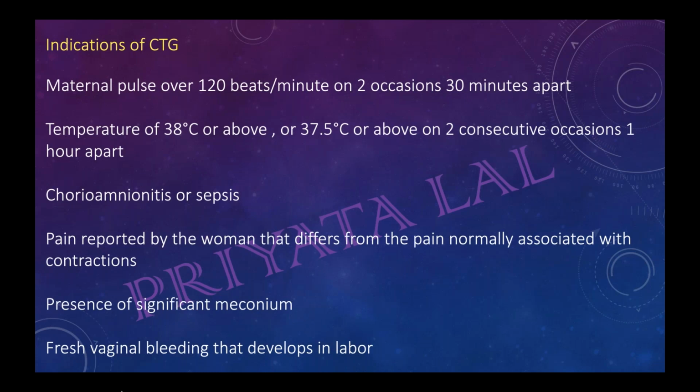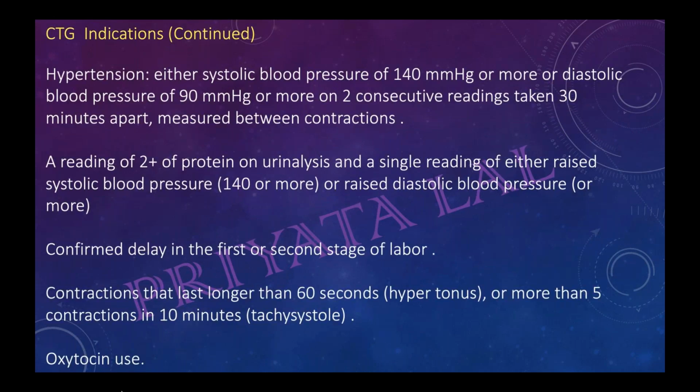Yes, ma'am. So these are all indications for continuous CTG monitoring in the UK. Yes, in the UK, because in this class, what I have made, everything will be UK practice and NICE guidelines, because we are studying for the UK exam. So no other thing I have included in the class. Fine.